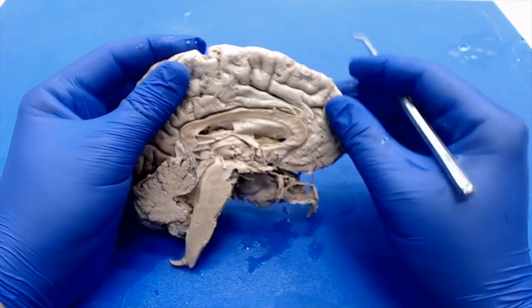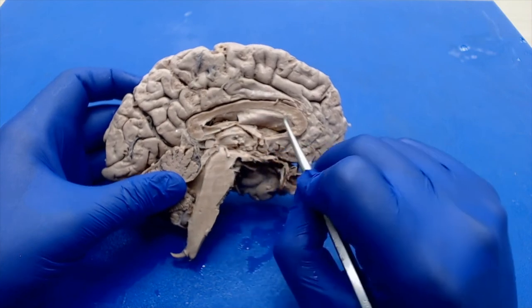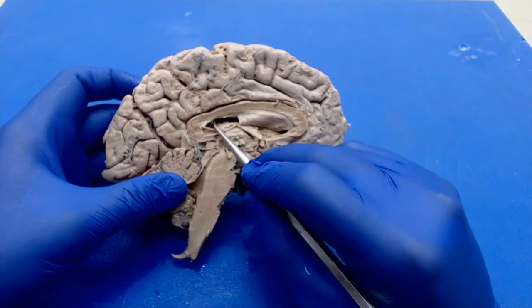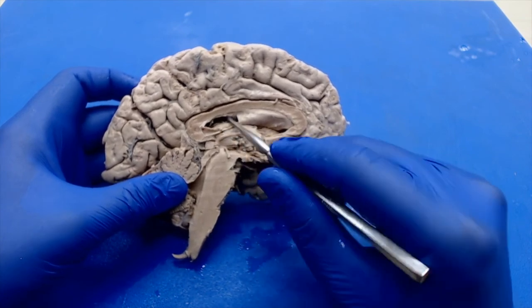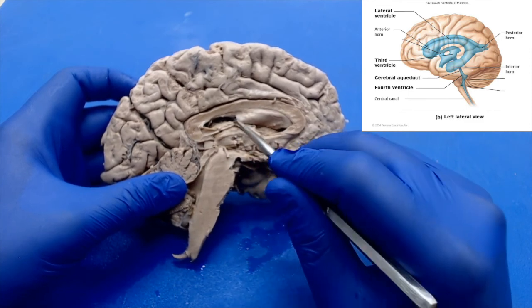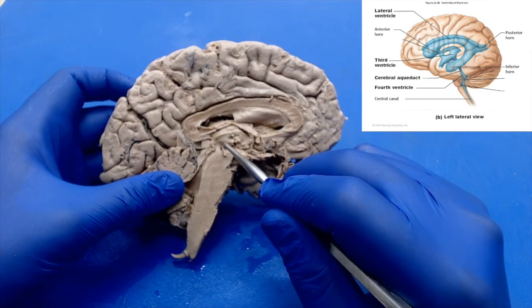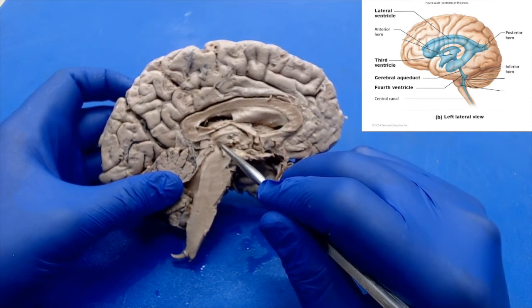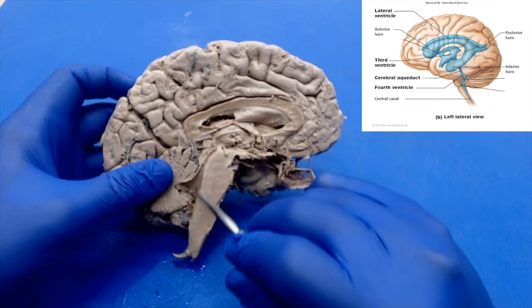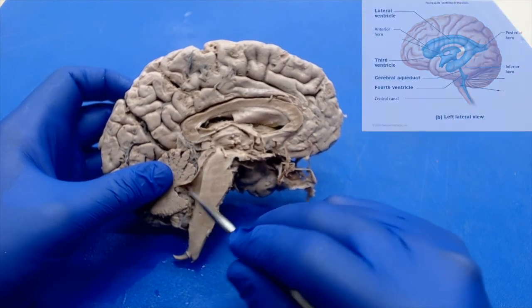Another prominent feature you'll see on the midsection is the corpus callosum, which is at the top of your lateral ventricles. The ventricles are the spaces that contain all your cerebrospinal fluid. You should be aware of the different ventricles. We have our lateral ventricles in the left and right hemispheres, and those drain into your third ventricle, the space right inside your thalamus. The cerebral aqueduct drains the third ventricle into the fourth ventricle, which is a space right behind your brainstem, anterior to your cerebellum.